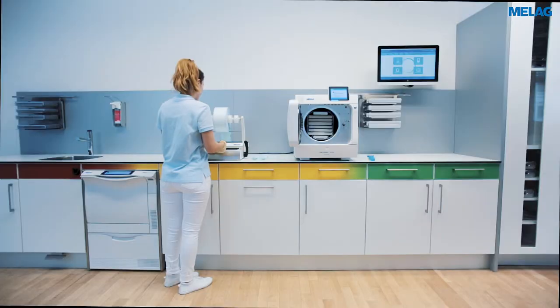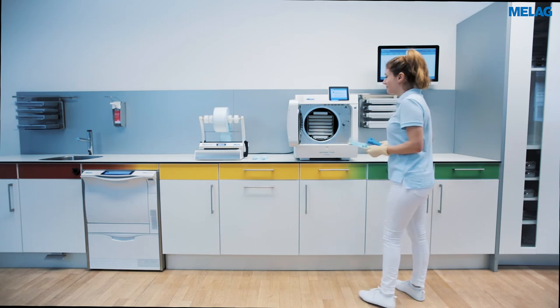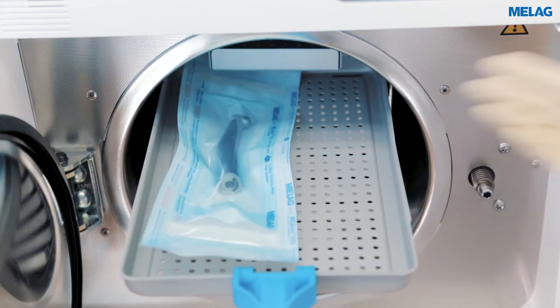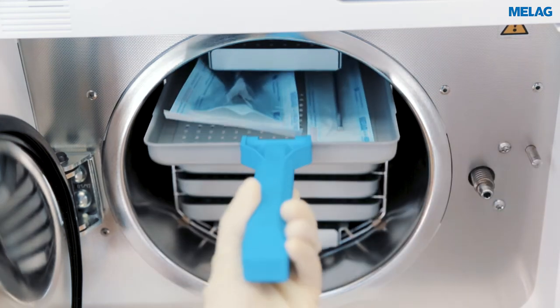When loading the steam sterilizer, please make sure that sterilization pouches are not placed on top of each other. Please place the pouches in an upright position on their edge, or with the paper side facing downwards on the tray.